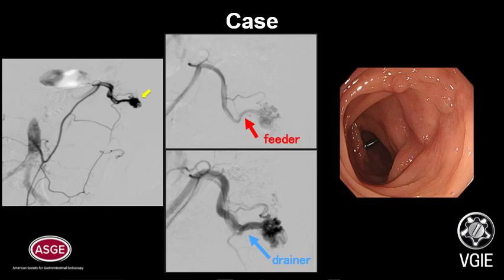2 months postoperatively, endoscopy showed that the AVM had shrunk with evidence of scarring. Furthermore, the hematochezia had disappeared and the hemoglobin level improved to 14 grams per deciliter.